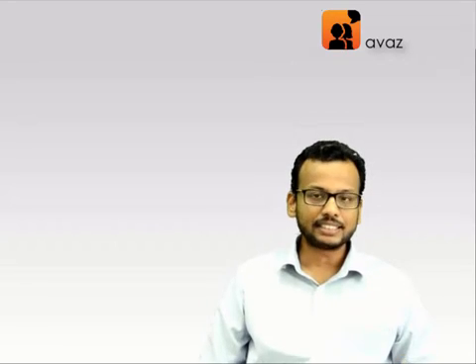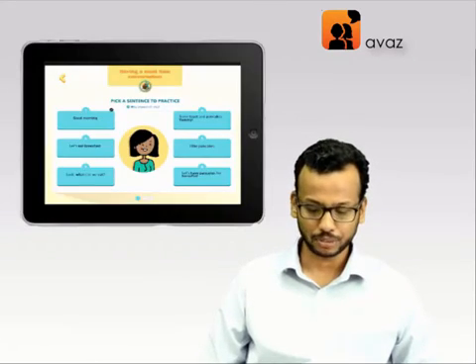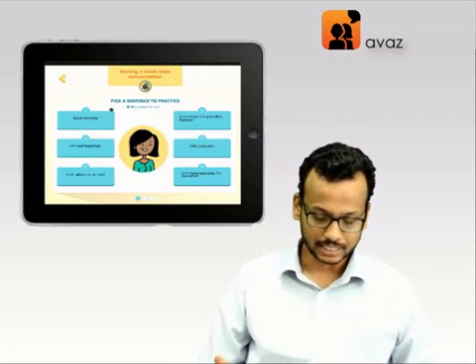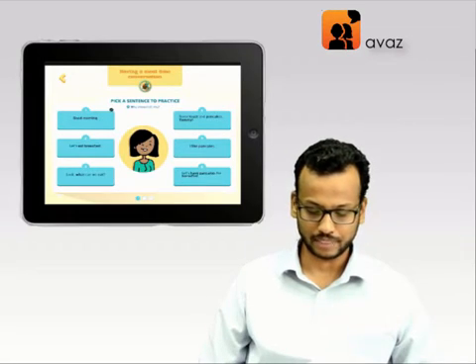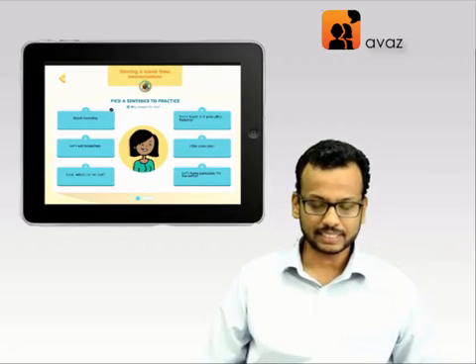But Avaz has a very interesting way by which you can develop this fluency in a simple, practical way. And this is called Avaz Conversations. So on this screen you see Avaz Conversations for one specific activity, specifically the activity of eating or having conversations during meal times. And you can see that there are 6 different sentences here.